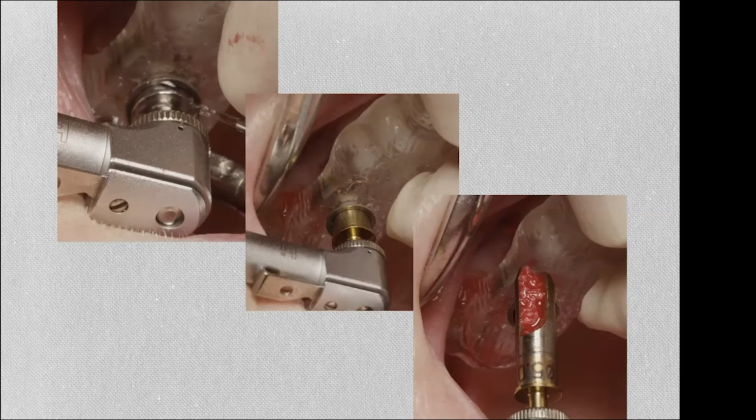Now with irrigation, we take one pilot spade drill. We do it once, and that takes roughly about 5 seconds. With irrigation, the bone, remember, is very soft and very shallow. Then we use the 5x5, the first reamer in the kit. Now you may have to go a couple of reamers if you're doing a longer implant, but if you're doing an internal lift, I will tell you 99% of the time you are only going to need the very first reamer, because otherwise you could just put a short implant with no sinus lift, period. So you do the 5x5, you get some bone. That's step number 3.